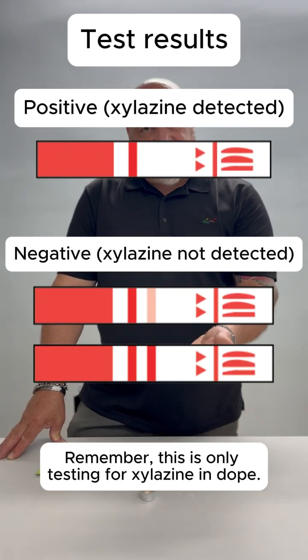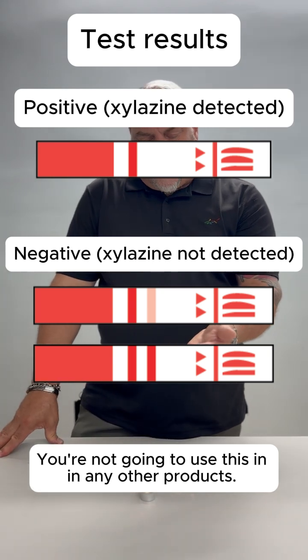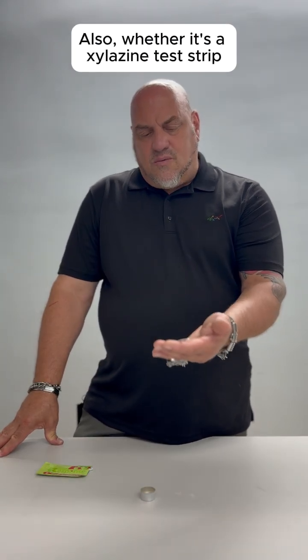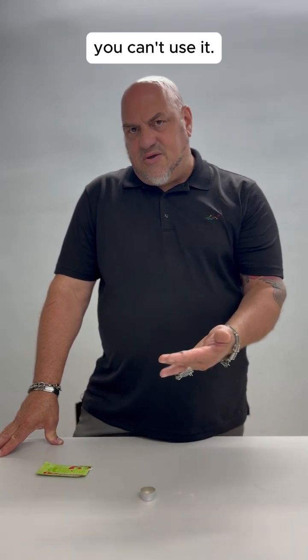Remember, this is only testing for xylazine in dope. You're not going to use this in any other products. Also, whether it's a xylazine test strip or a fentanyl test strip, if it is expired, you can't use it.